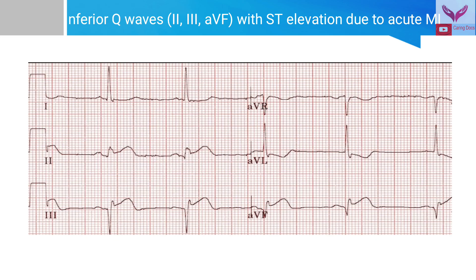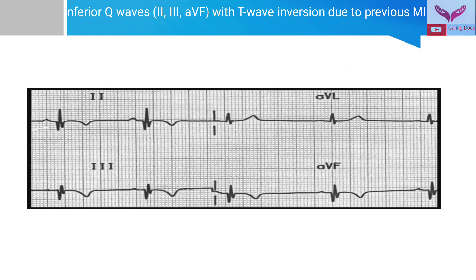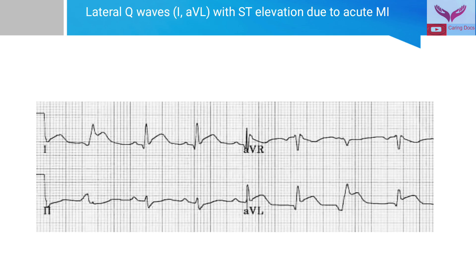Here we can see inferior Q-waves, i.e. Q-waves in leads 2, 3 and AVF with ST elevation due to acute MI. In the ECG we can see Q-waves in leads 2, 3 and AVF with T-wave inversions due to previous MI.